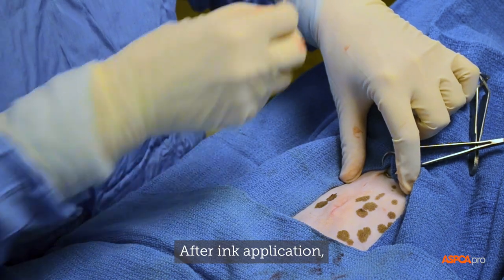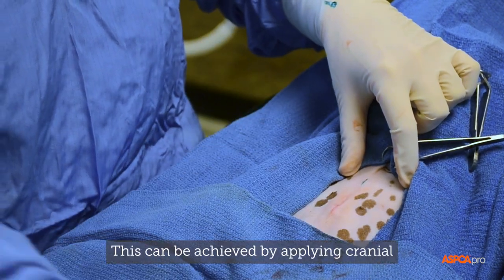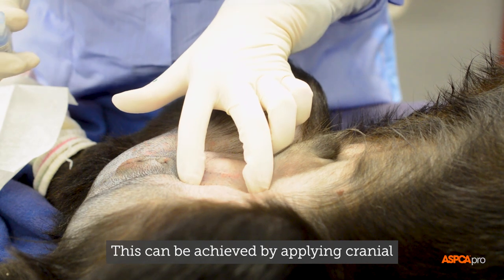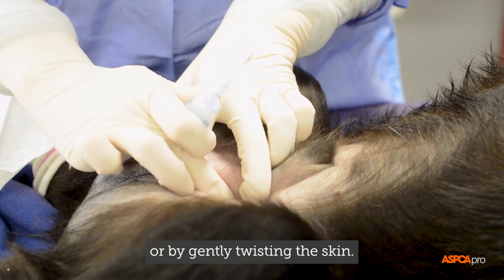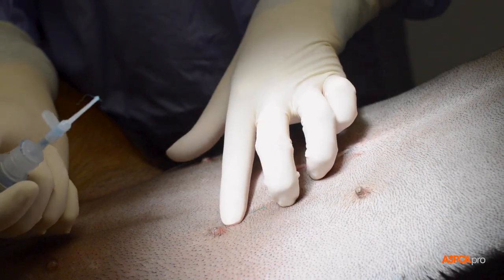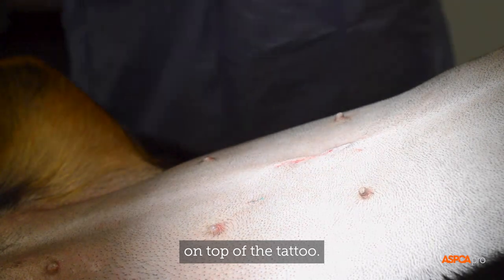After ink application, the edges of the scored area are held in opposition. This can be achieved by applying cranial to caudal tension to the scored area or by gently twisting the skin. While the skin edges are opposed, a minimal amount of glue is applied on top of the tattoo.